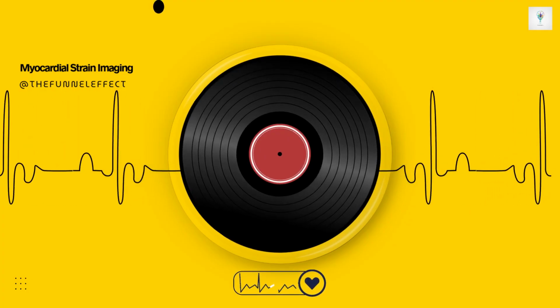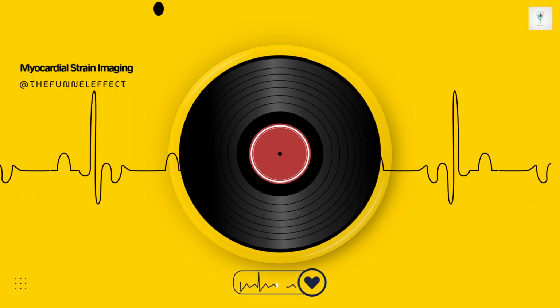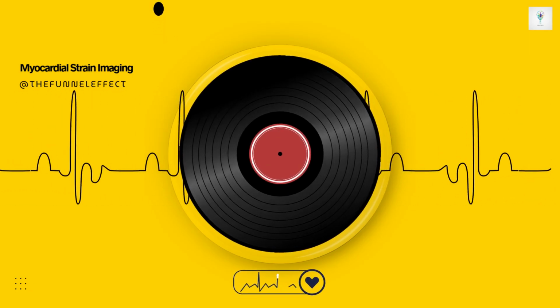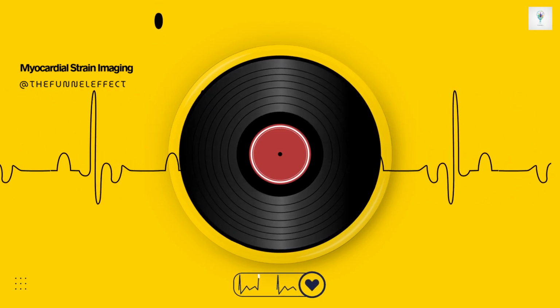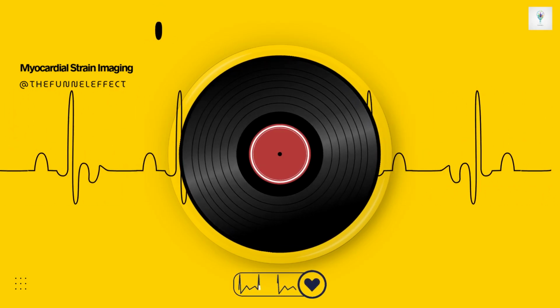So careful manual adjustment of the ROI is often needed to ensure you're tracking the full thickness of the moving myocardium and nothing else. Okay, third critical pitfall, timing. Defining exactly when contraction starts and ends. Timing is absolutely essential because strain is measured over the cardiac cycle, and we're usually interested in the peak value.